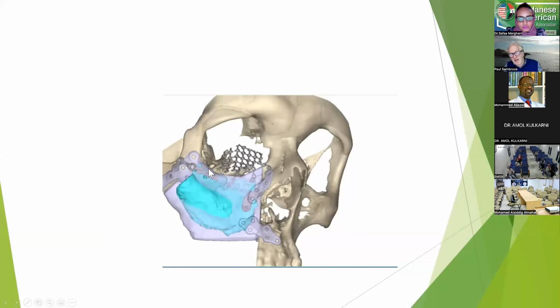So this one is a scapula. And again, the three-dimensional look at the scapula here: in the past, to try and freehand that is very difficult for a very experienced surgeon. You have to take a large amount of scapula, bring it in. There's lots of fiddling about, lots of refashioning, trying to put it in, never quite getting it right. But with this, you can cut it to the correct spot.